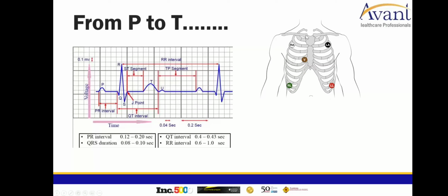And so it gives me different views of the heart. And so therefore the EKG tracing may look slightly different, as you would see on a 12-lead EKG, which looks at the heart from all points of view. But we want to look at it from a standard view, or a lead 2 position is what we usually would see in telemetry, and see this configuration.